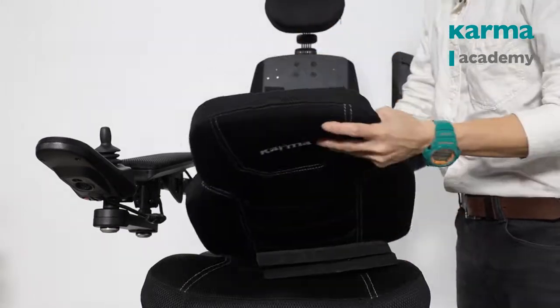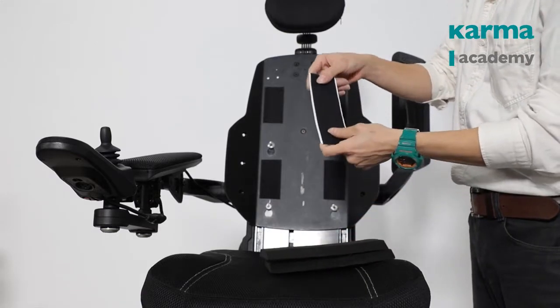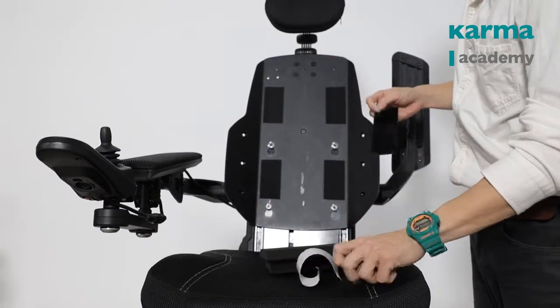Take off the backrest cushion. There is a velcro strap included in your lumbar support unit — stick it on the backrest pan.